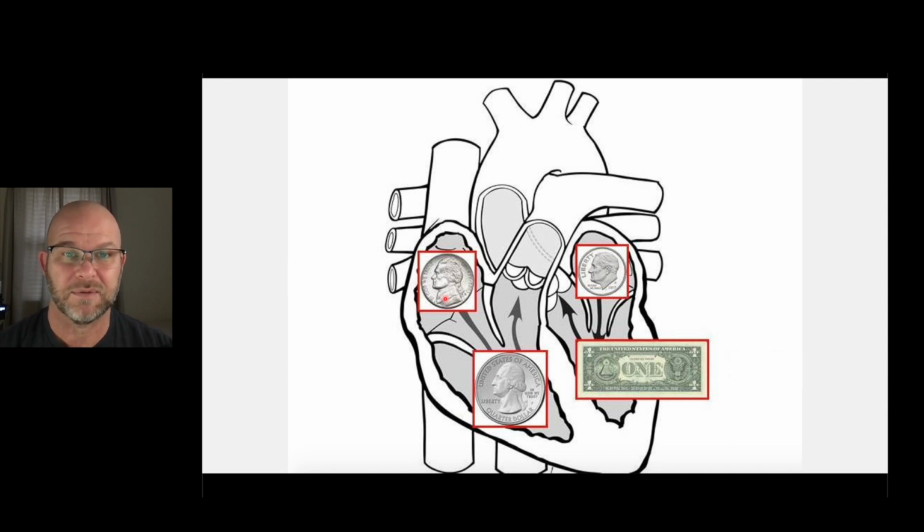AFib can cause clots to form in the left atrial appendage and then go to the brain, or there's this turbulent flow between the atria. Measuring sats throughout the body in different areas is called a shunt run, and it gives you a lot of information.